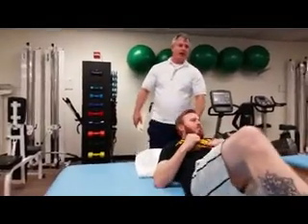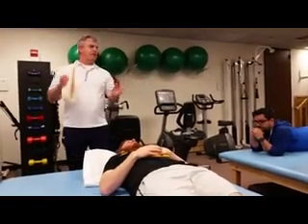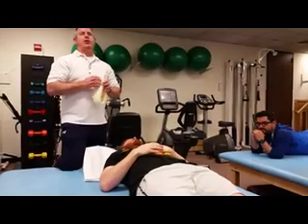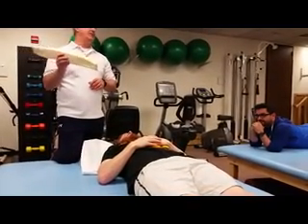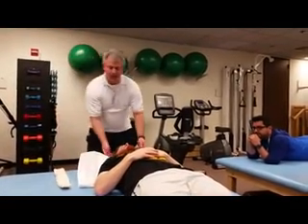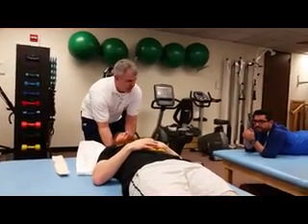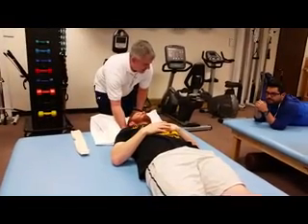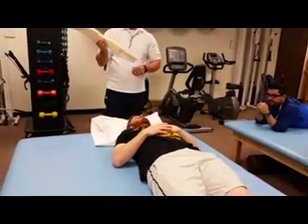What I'm going to do is make sure that I keep the head as much in neutral as possible. I'm not going to try to move his head too much. Most likely, if I'm using a soft collar, he's pretty okay. But what I would do is put my hand under his pillow. I'm going to hold his head, and I'm going to slide the pillow out, and let the head down. Now I have a little space that I can slide the cervical collar underneath.